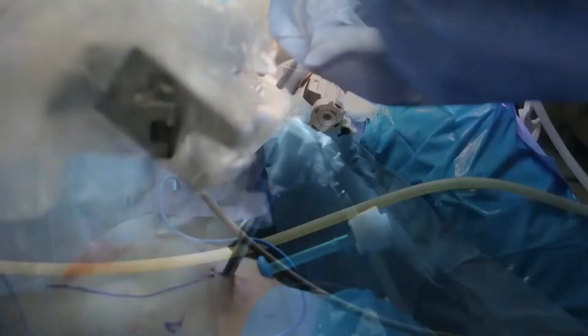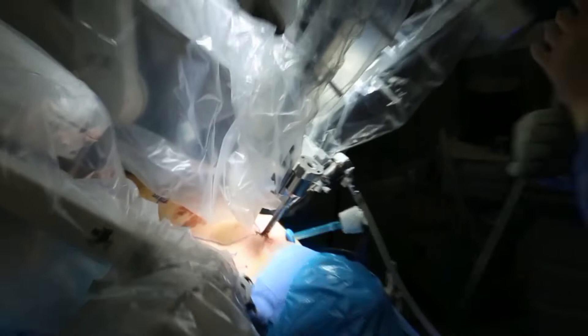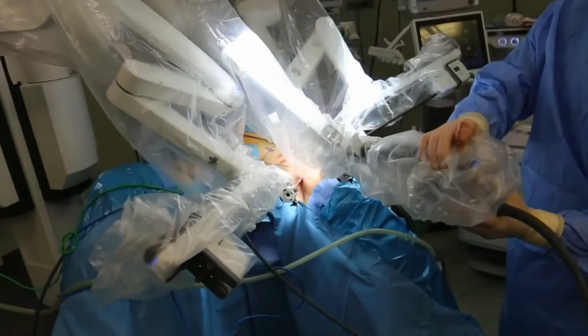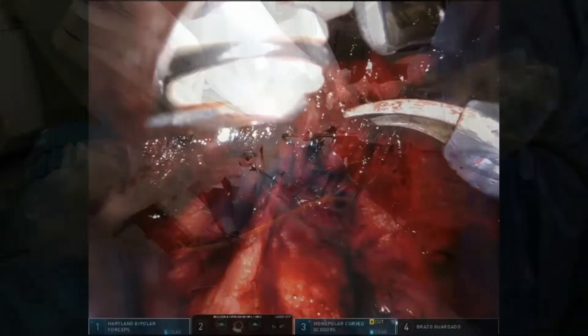Now I have four trocars already placed and I'm doing the docking. If it was an Xi docking it could be much easier because you can place the robot between the legs of the patient and go to one side and then the other without moving the patient cart. In this case it's a little bit more difficult, so if you want to go to the other side you have to move the patient cart. We will start with the left side. Now I'm going to move to the console to start with the case. At the beginning it's very important to have the trocars almost out so that you are able to start to move your instruments.